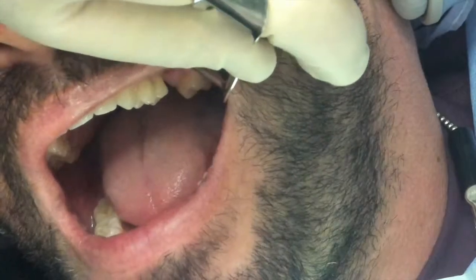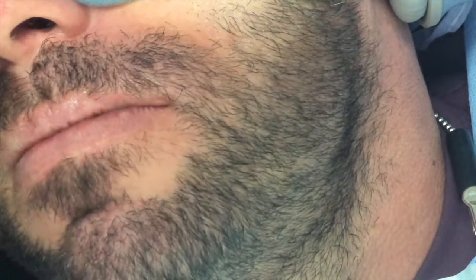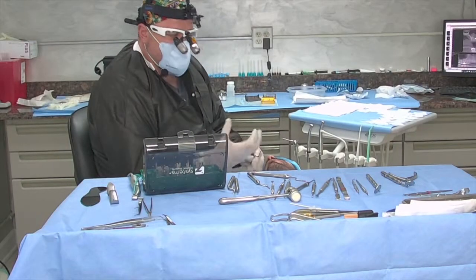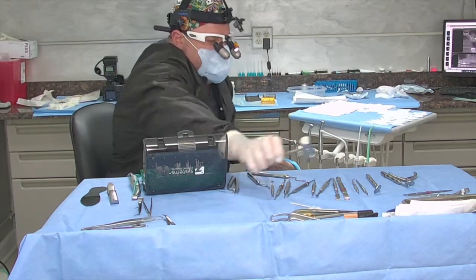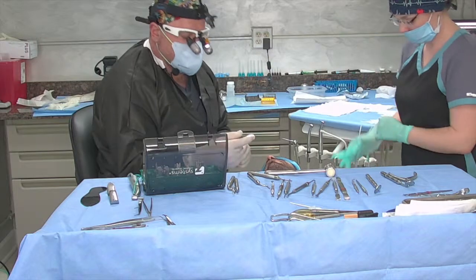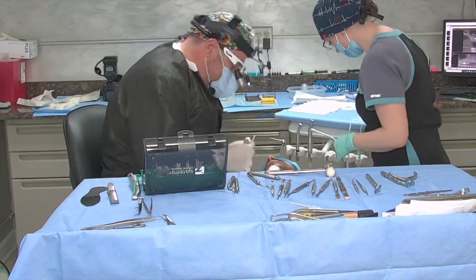The 3.8 osteotome. Right down? Okay. Set osteotome. I like to make sure I'm not cutting anything. And also this concavity, it's good to hold the graft, to condense the graft. And I like the freedom of having that, I'm controlling this cut instead of the point of the osteotome controlling the cutting. Okay, this might be a tap.